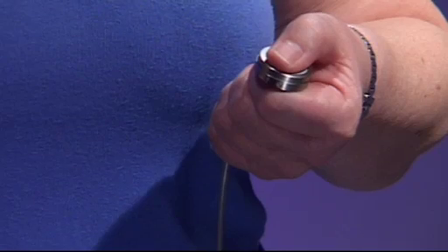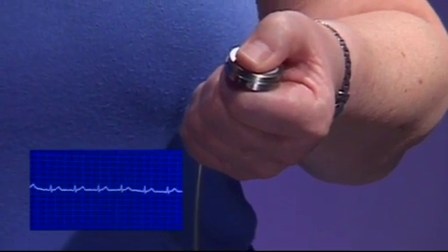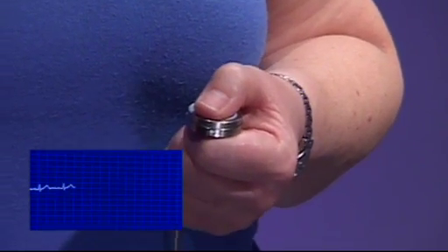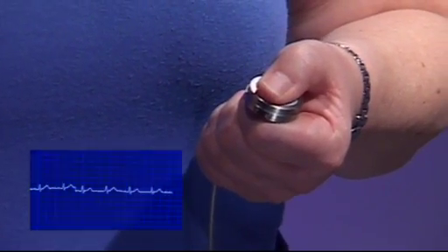I'm measuring it using just two of our sensors that I'm touching with my thumbs. Because of the way the sensors are built, I don't have to make any electrical contact to them, so I don't have to apply any gel or prepare the skin. I can literally just touch these insulating sensors and measure the difference in potential across the body. Comparing the two signals, I get the predominant signal which is coming from the heart.